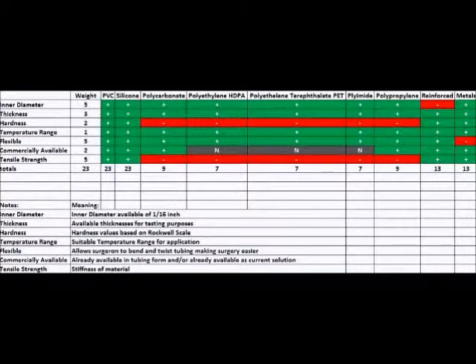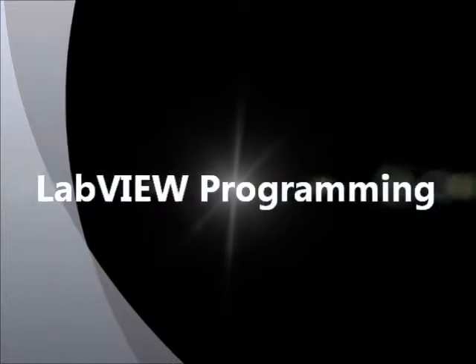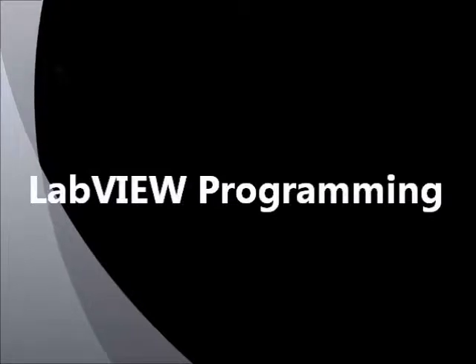Lastly, a metallic tube would be ideal, except that metals are not flexible, which makes it hard on the surgeon. So, we decided to focus on different types of PVC and silicone tubing with varying thicknesses and tensile strengths. Now that we have a better idea of where our project is headed, we decided to incorporate some LabVIEW programming. Here is the process of how our program came about.